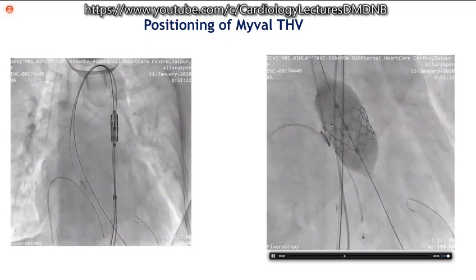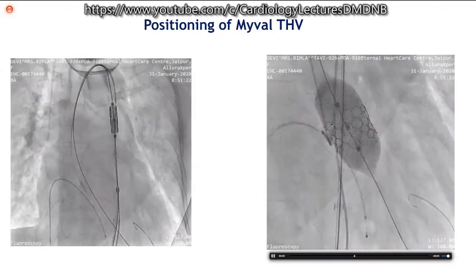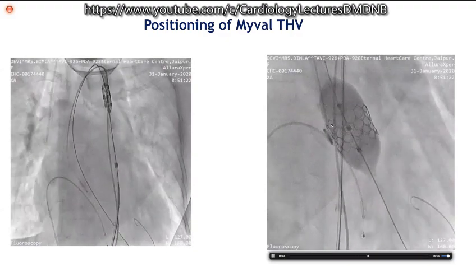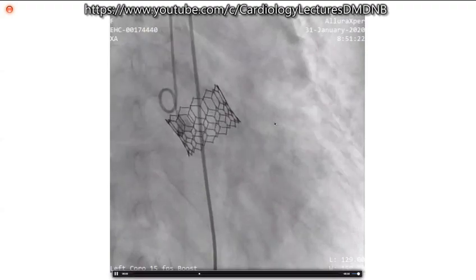The other way to do it is, you can use another pigtail, park it in the left sinus, and use it as a marker for the annular plane, because there is no calcium at all. And sometimes you can be easily misled in deploying this valve. So a 27.5 mm valve was deployed. And this is the final aortogram.